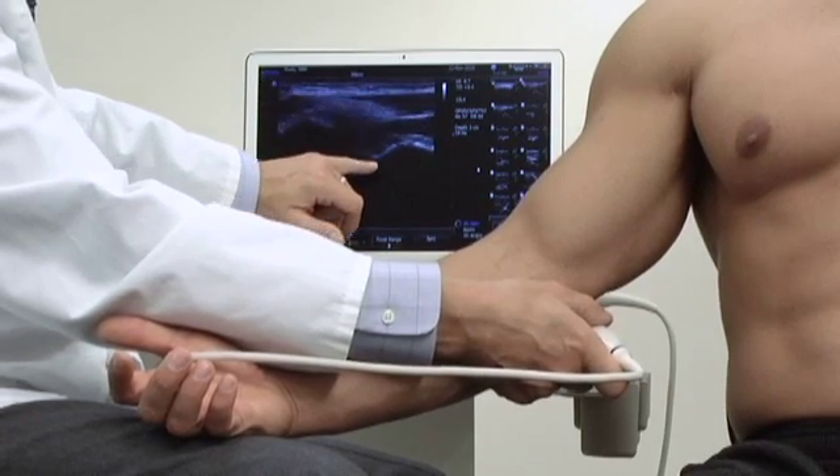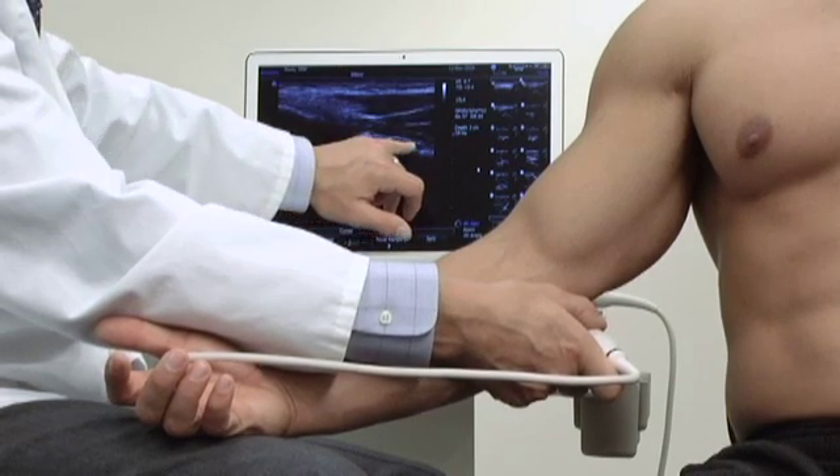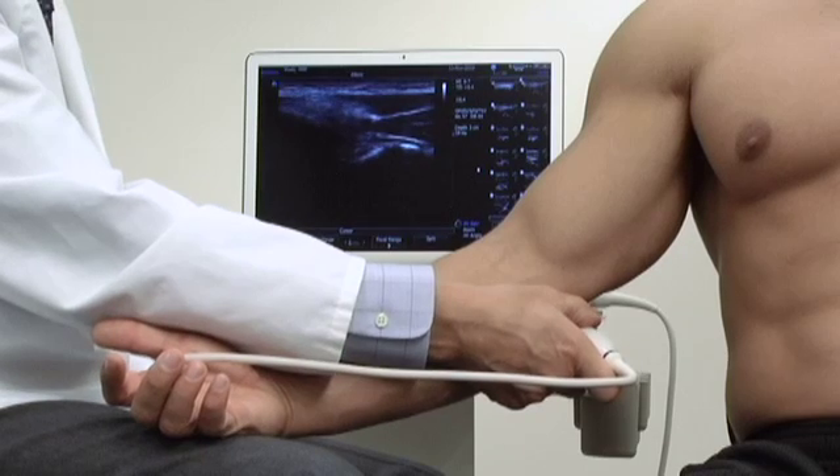Deep to that we can actually see the joint line, and flowing over that is the ulnar collateral ligament.